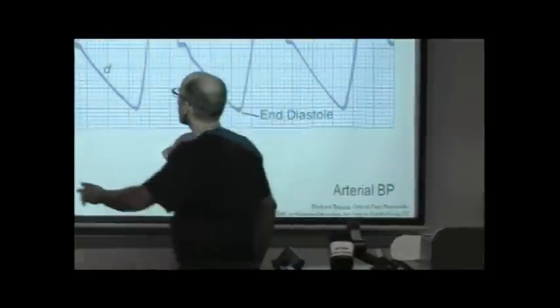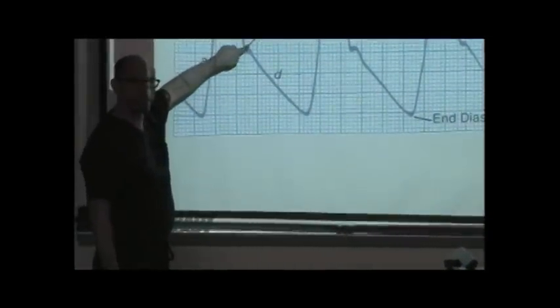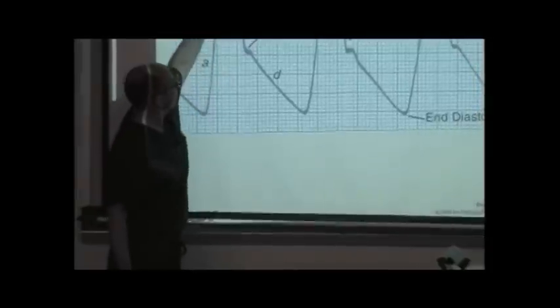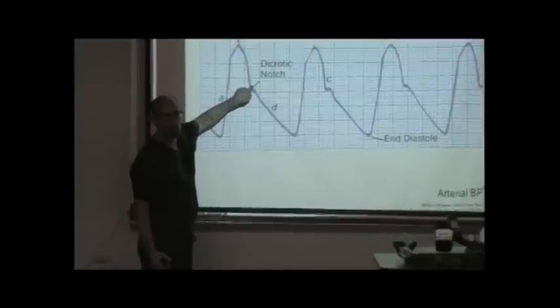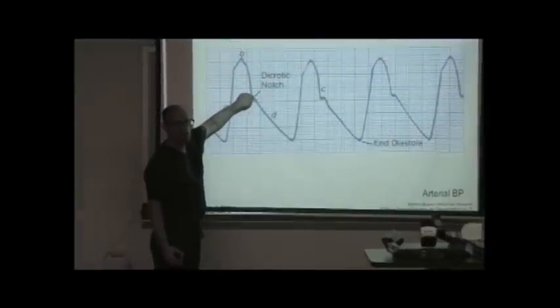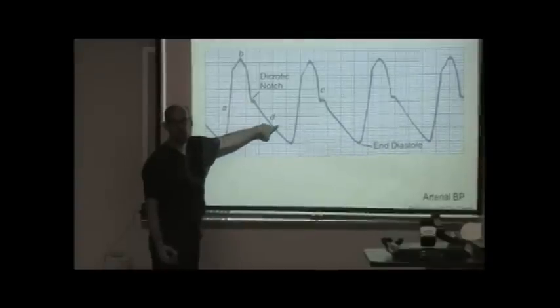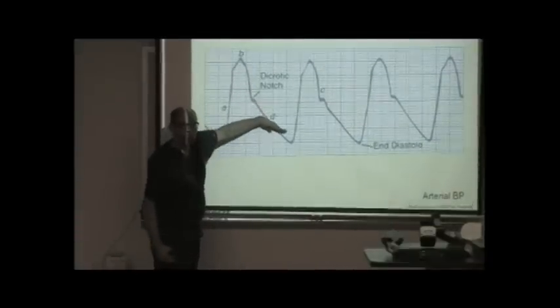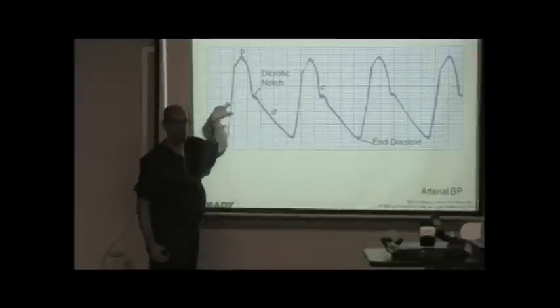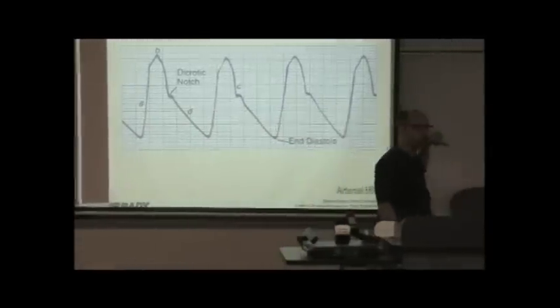You should know, for purposes of when we talk about balloon pumping, that all of this is systole. So the heart is still contracting through all of this until the dicrotic notch. The relaxation phase, or diastole, starts at the dicrotic notch down. So the heart is squeezing, relaxed. It's the dicrotic notch that is the start of diastole. File that away for later.